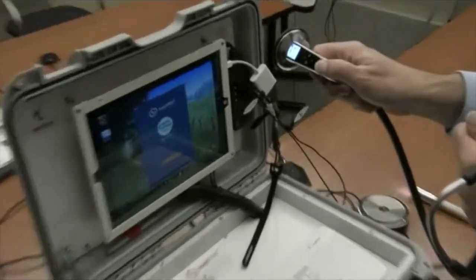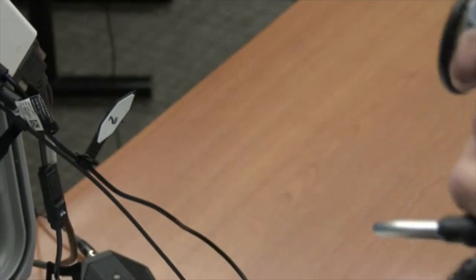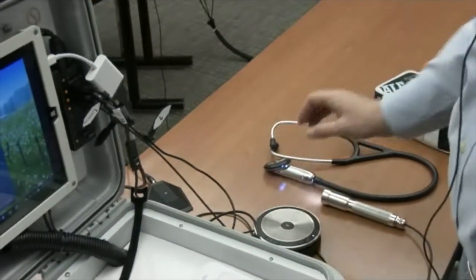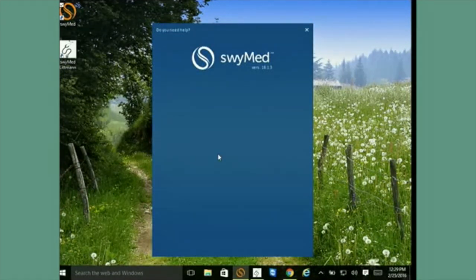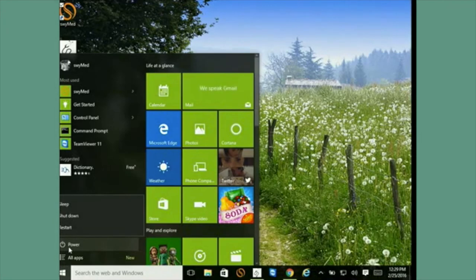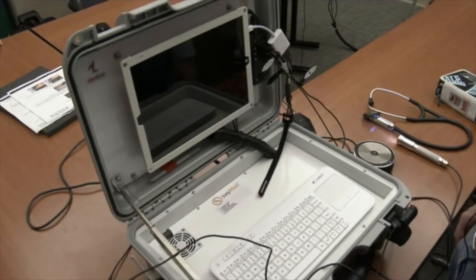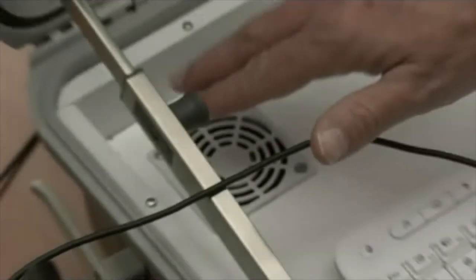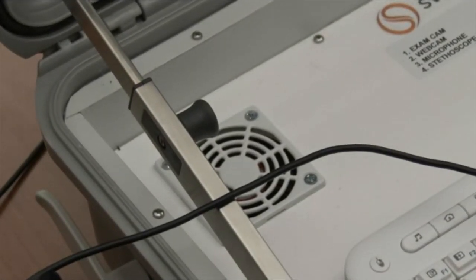When you're done, switch off the Littmann stethoscope. The Littmann runs on batteries, so monitor the battery level and replace when needed. Next, go to 'more' and click 'quit SWIMED,' confirm, and quit. Then go to the Windows icon, select power, and shut down. Wait until the system has shut down, then press the power button to turn off the power. You can confirm it's off by checking the vent fan — if there's no noise or air coming out, it's turned off.